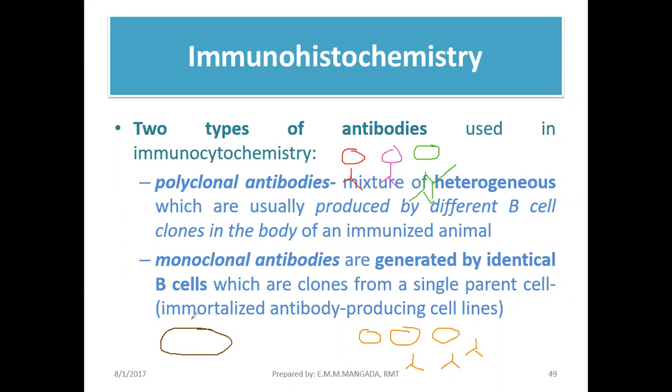Ito siya. Guys, no, yung antigen natin, it has what we call these epitope. Okay, yung mga active sites ng antigen natin. Okay, so this is where actually your antibodies are binding the antigen dun sa epitope nila. Okay, so epitope. So you will know more of this pagdating nyo sa immunology and serology. So guys, no, yung antigen na to ay meron siyang iba-ibang epitope.